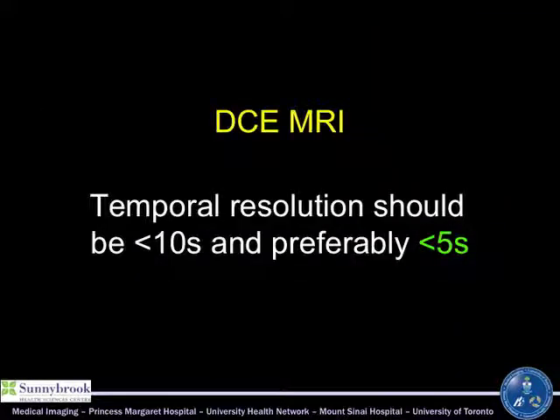In speaking with the residents yesterday, I think it's very important that urologists start to become familiar with MR as a modality. It's something you really don't see much of in your training, and it's something new. So when we're talking about these techniques, what are we talking about? The first is dynamic contrast enhanced MR, in which we inject a standard gadolinium contrast agent, but we image very rapidly through the prostate. We're imaging the prostate every 5 seconds, and we get this movie of the contrast enhancement in the gland.